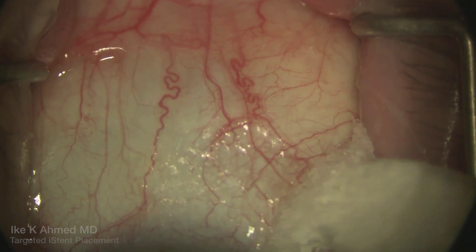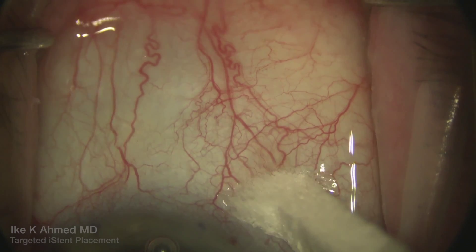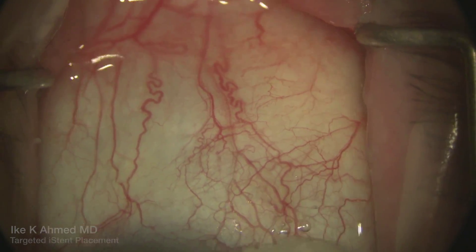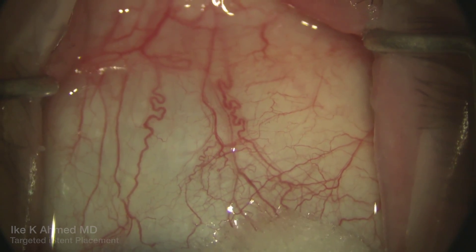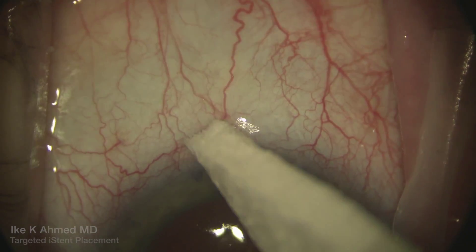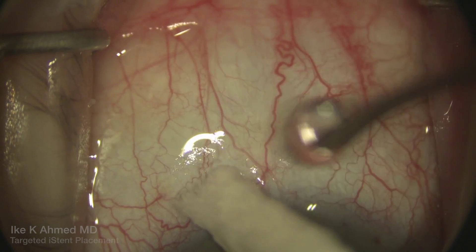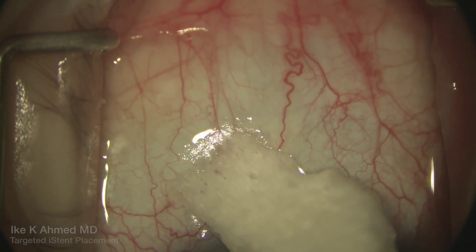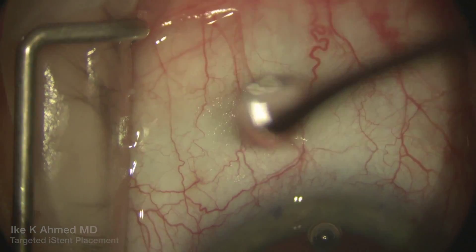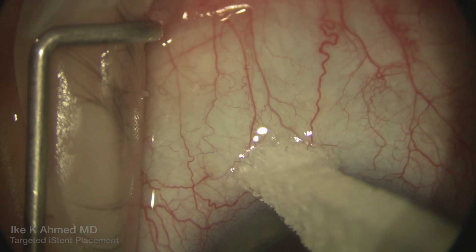There was an interesting vein coming off tangentially, heading more posteriorly in a radial fashion, showing the aqueous flow here. This aqueous flow is laminar in its presence within the vein, as well as pulsatile. Some pressure on the globe helps to exaggerate the pressure changes within the vein to show the laminar flow and the aqueous patches within the episcleral venous system.